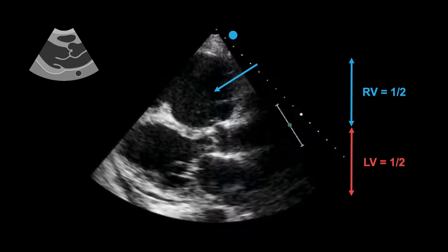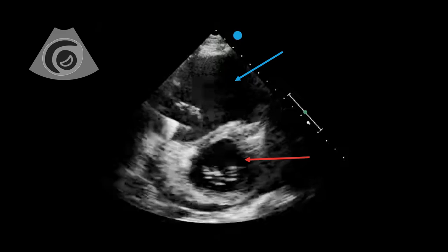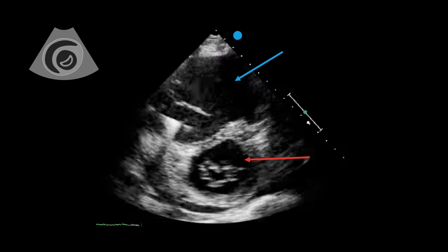The same is true in the parasternal short axis view. Again, the right ventricle looks larger than the left, and there is hardly any motion during systole when you would expect to see the ventricle contract.